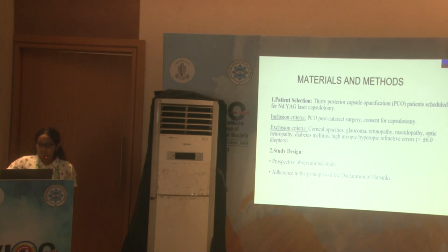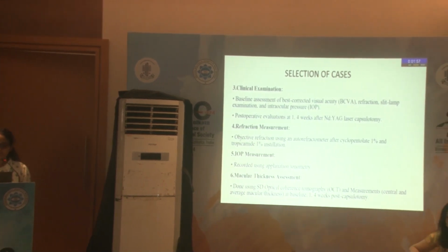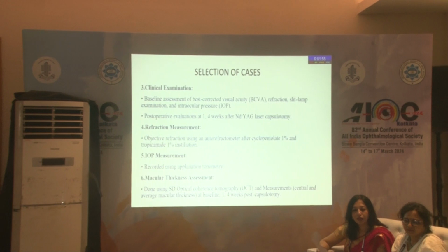This is a prospective observational study, and we have taken baseline best corrected visual acuity and IOP measurements, and the pre-operative, pre-laser macular thickness evaluation is done. Dilatation is done using cyclopentolate and tropicamide, and IOP measurement and the macular thickness assessment are done pre-laser.